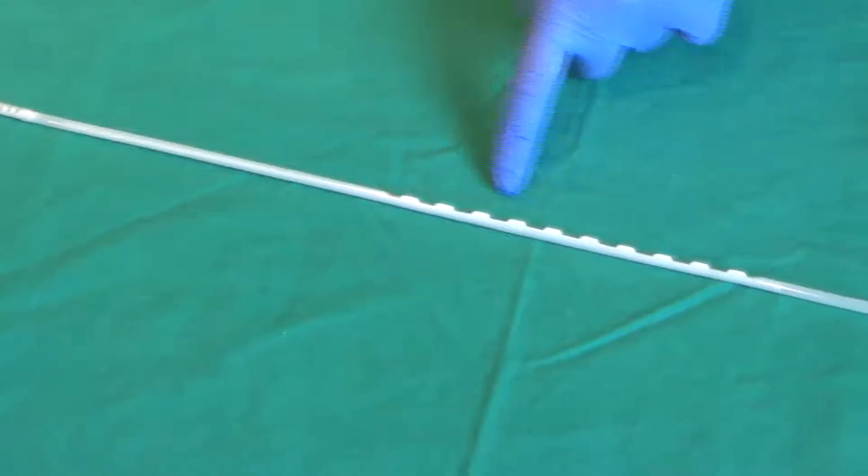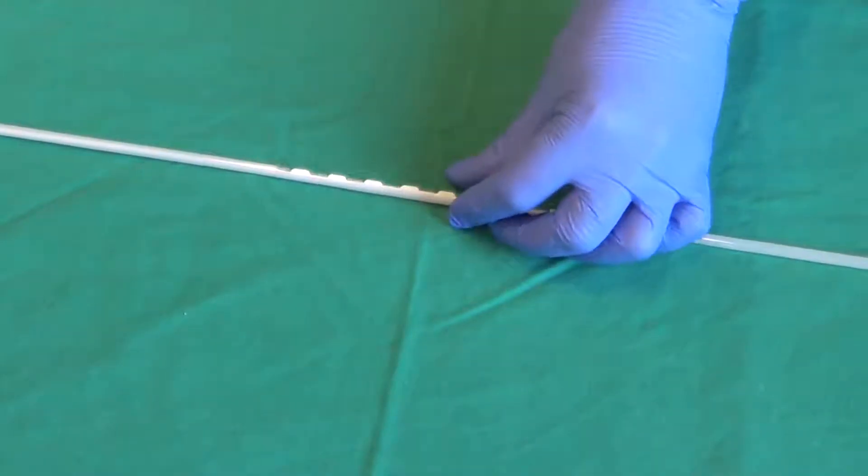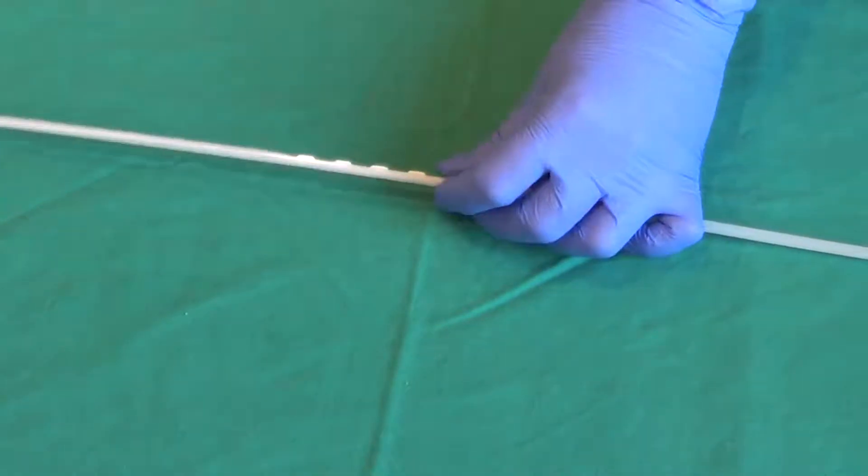A slider is used between the thumb and forefinger to move the tip anteriorly and posteriorly. The slider has blunt teeth to allow grip with disposable gloves.